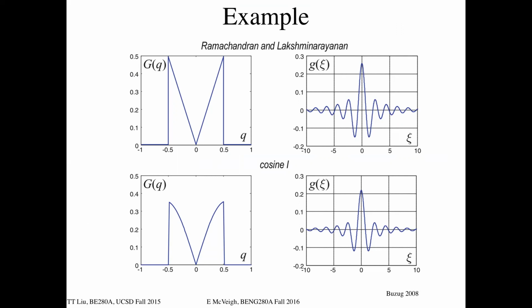And so over time, even though this is analytically what you need to do to your data to recover your object exactly, in a noise situation and in a situation where you're slightly undersampled, this will produce issues, right? Having a filter that abruptly changes from its maximum value to 0 at the highest frequency is not usually a good idea in any kind of signaling. If you have absolutely noiseless data and you are sampled absolutely adequately, things will work out.